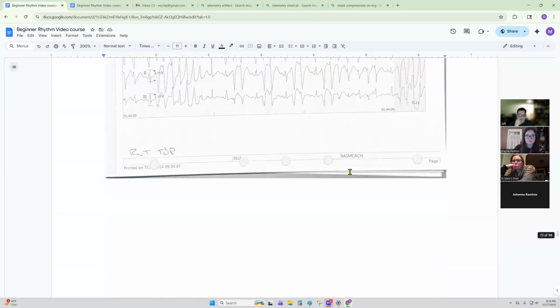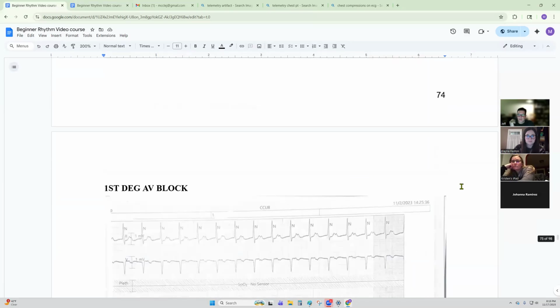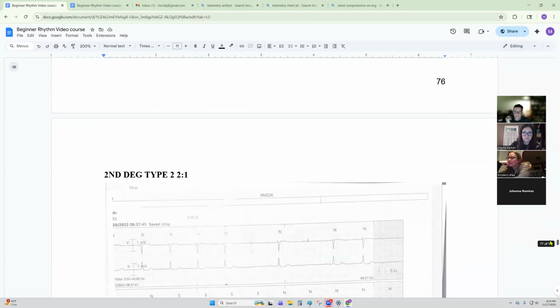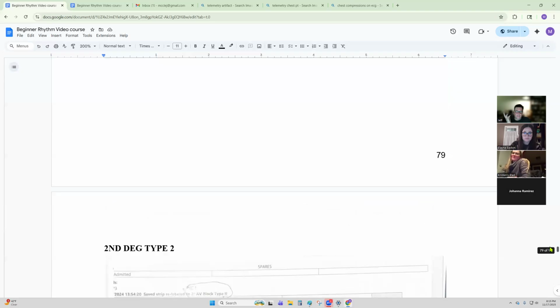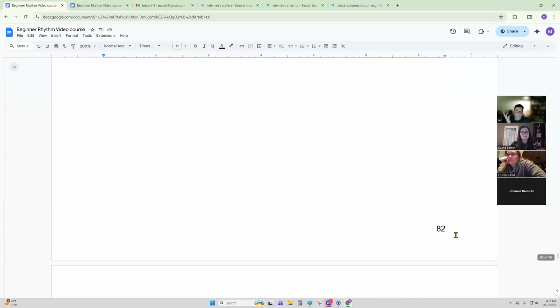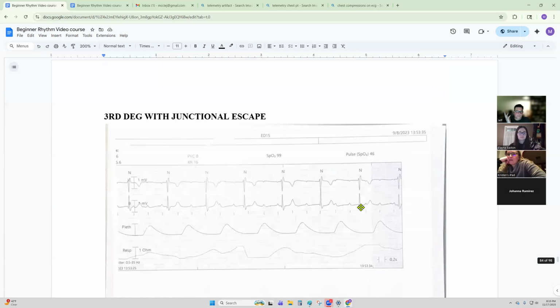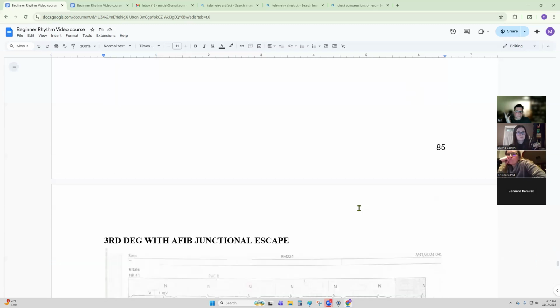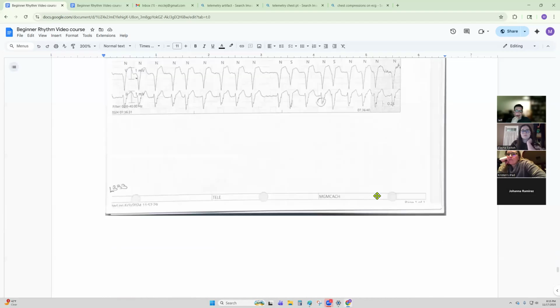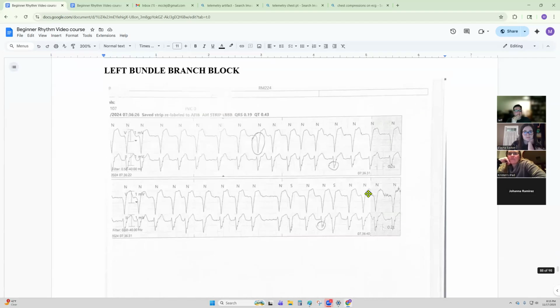Sorry, where are my bundle branches? I think you had more of them at the beginning, didn't you? Way back. Oh. Degrees. So, all right here. Oh. All right. Okay.